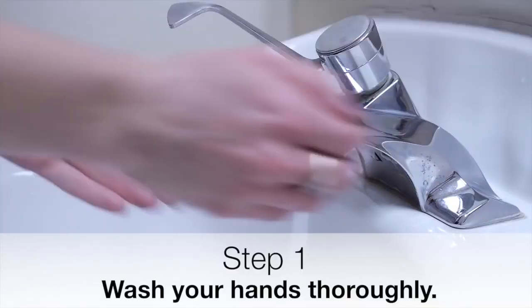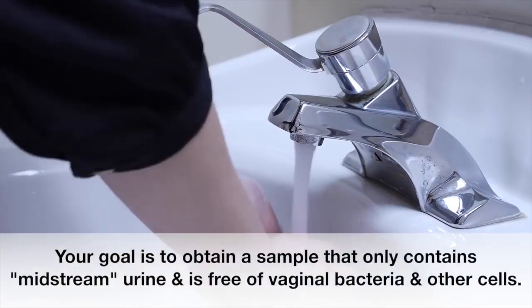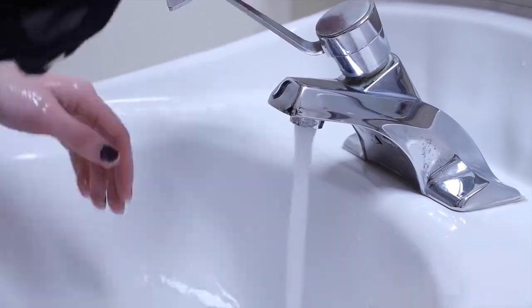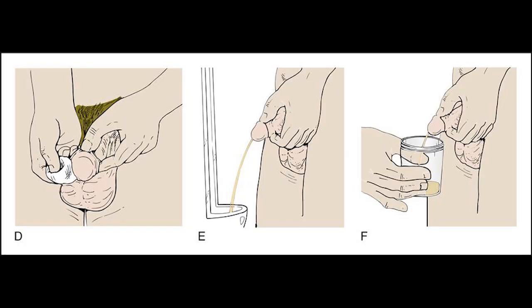Male patients must: 1. Wash hands thoroughly with soap and water. 2. Wash the head of the penis with a towel or soap pad. 3. Collect the midstream urine.